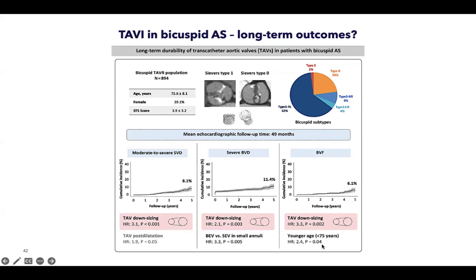That's maybe because younger patients are easier to reintervene on, you want to go for the perfect result, but also because the initial result is often less good, as these younger patients have more excessive calcification and longer calcified raphe. So you have a higher risk of a suboptimal TAVI result initially in your index procedure in these much younger, severely calcified cases.